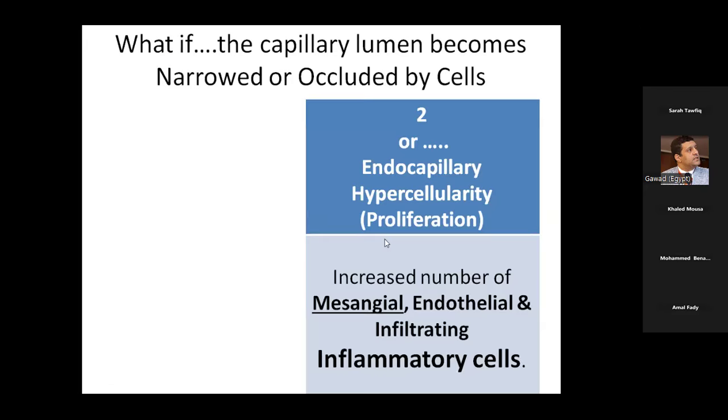So that's situation one. I hope that the idea is clear for you. We didn't talk about when this occurs, but I just want to deliver a message that that occlusion could be. Situation one, is there a terminology explaining situation one? As in situation two, you will call it endocapillary hypercellularity. In situation one, is there a terminology or a name for it? It's just an endothelial injury.